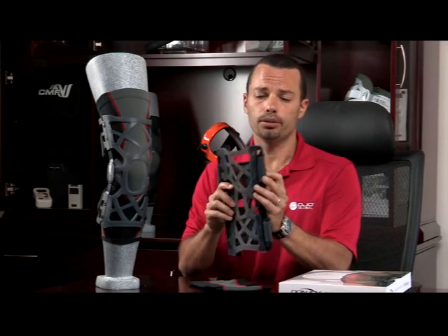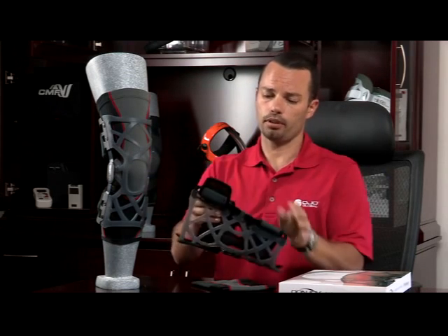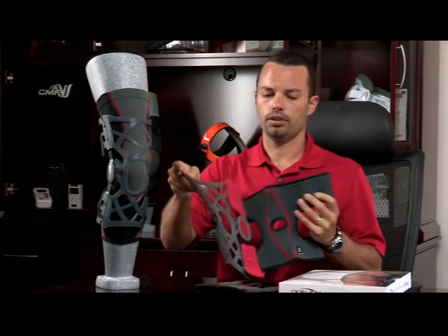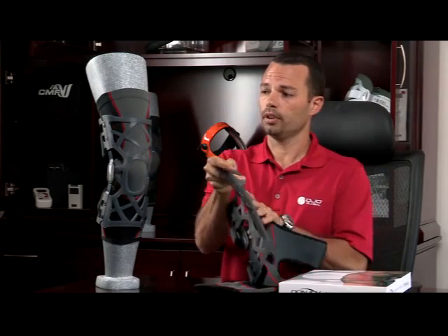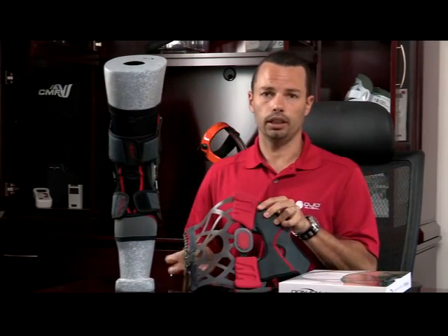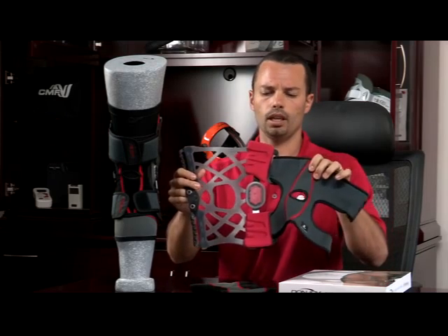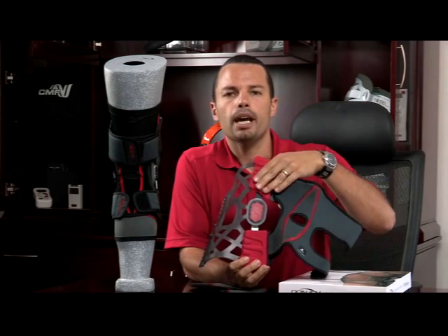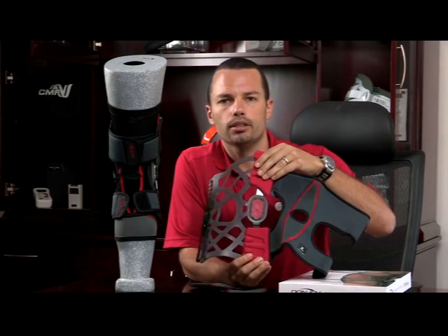Second, it's very easy to use. It has adjustable straps on the back to get in and out of it easily. As you can see here in the back, this is how it wraps when it's on the leg. And lastly, it has some unique features on the inside. It has padding on the side of your knee so that it's nice and comfortable.